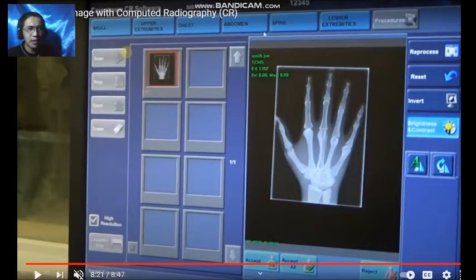For example, the examination required is for the upper extremity. If the imaging plate contains the image for an upper extremity examination, you should click the upper extremity option. Before pressing the scan, you need to pick what type of examination you did to the patient.